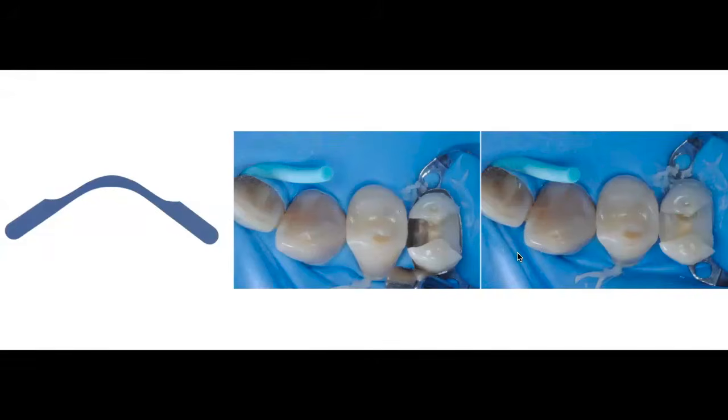Because if the band is 2 millimeters and the band is literally placed in the deep margin, you know that when you add composite, your composite is going to be 2 millimeters thick. So it also helps you with controlling the thickness of your increment, which is great because you don't want to place an increment that is greater than 2 millimeters and then have a problem with polymerization of your composite on that deep aspect of your box.